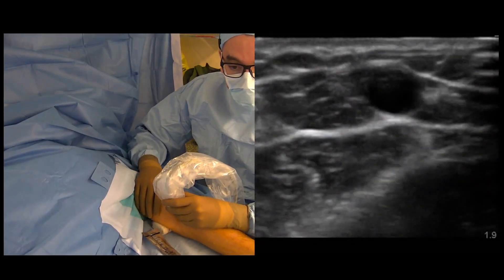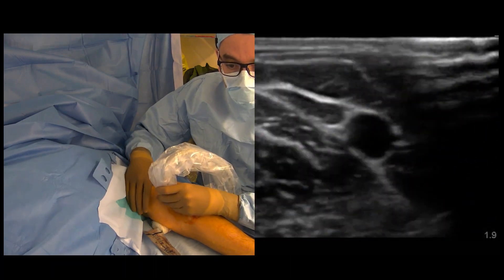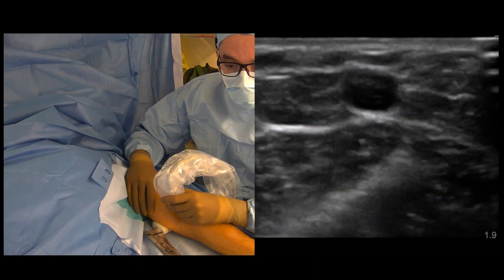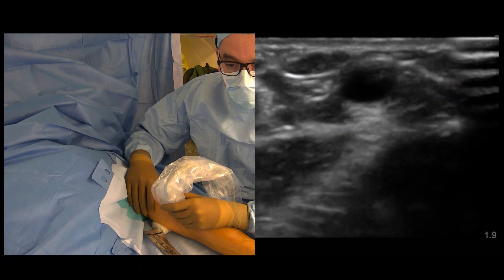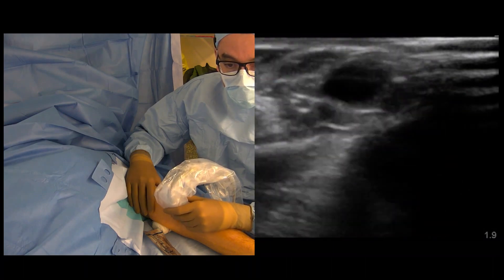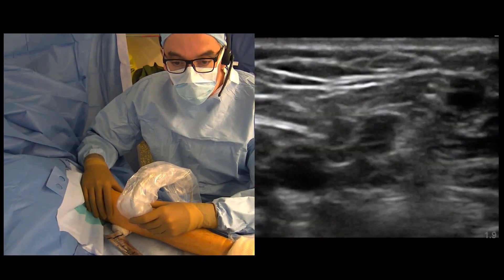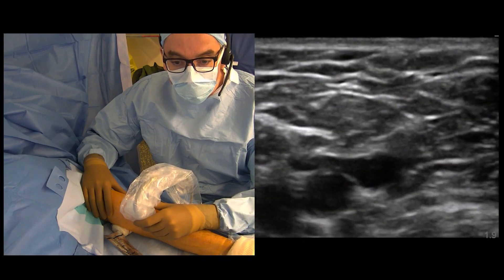I'm going to talk about the mapping. This is the cephalic vein of the patient — the vein we usually want to use for the fistula at the level of the patient's arm. This is a very good caliber vein; you can appreciate here it's about four to five millimeters. At this level you will see the deep communicating vein going down and coming to meet the proximal radial artery right at this level.